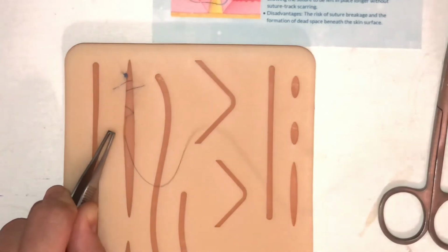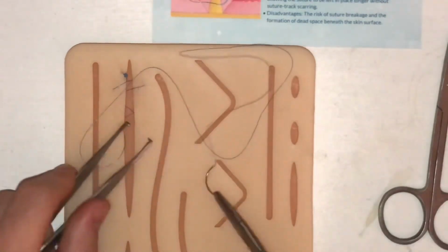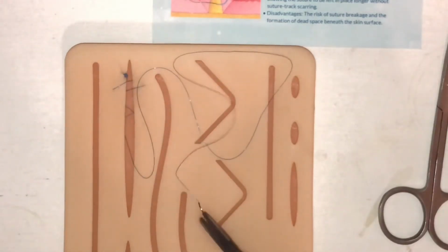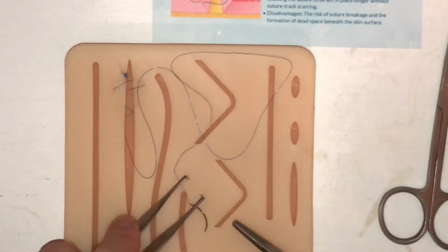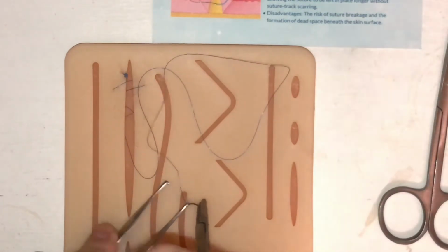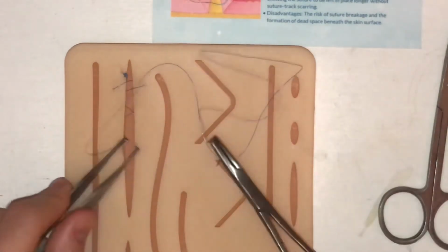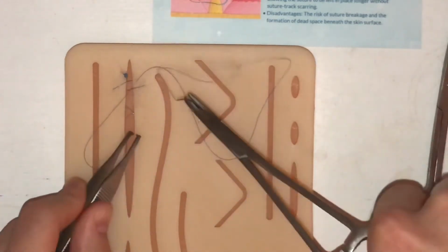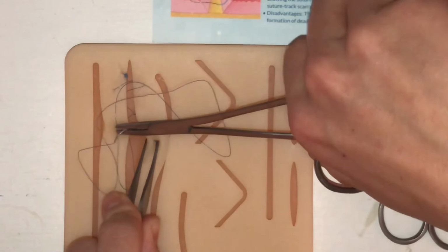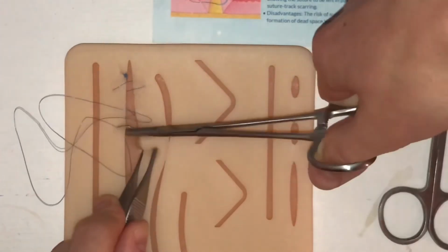I feel like it just gets in my way a lot, which is tough because obviously I don't think it would do that in real life, but real life would obviously also be way harder. So this thing is a lot harder for me to maneuver. Oh gosh. Now I can't touch the inside of the skin, but I also don't want to get inside the muscle, and that would hurt really bad.